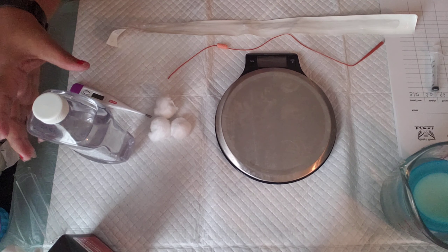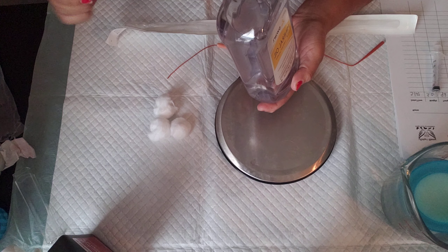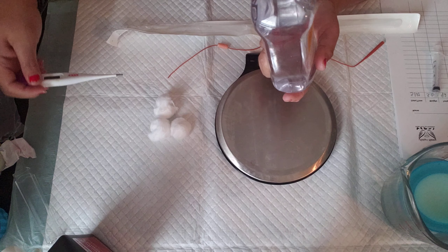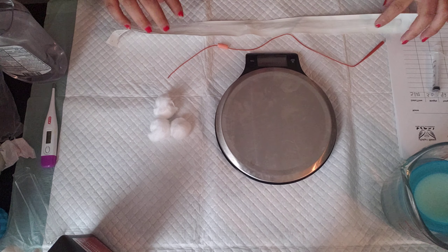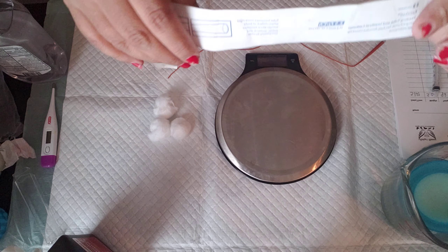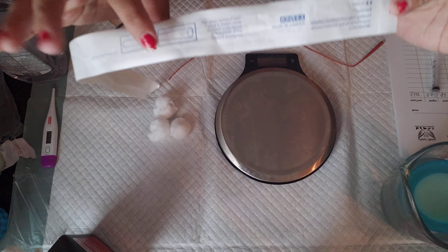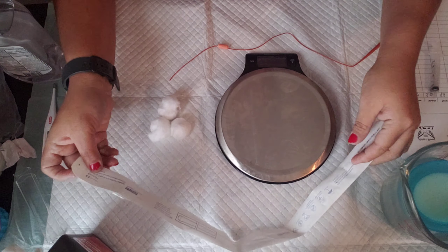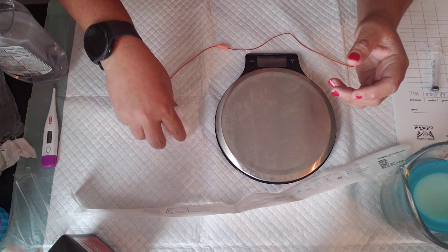You want to have some mineral oil and a thermometer — to take temperature and make it less uncomfortable. We'll be using a three and a half tube feeder, or catheter — people call it different things. You can get them on Amazon. Honestly, I can't remember the exact price, but not too expensive.